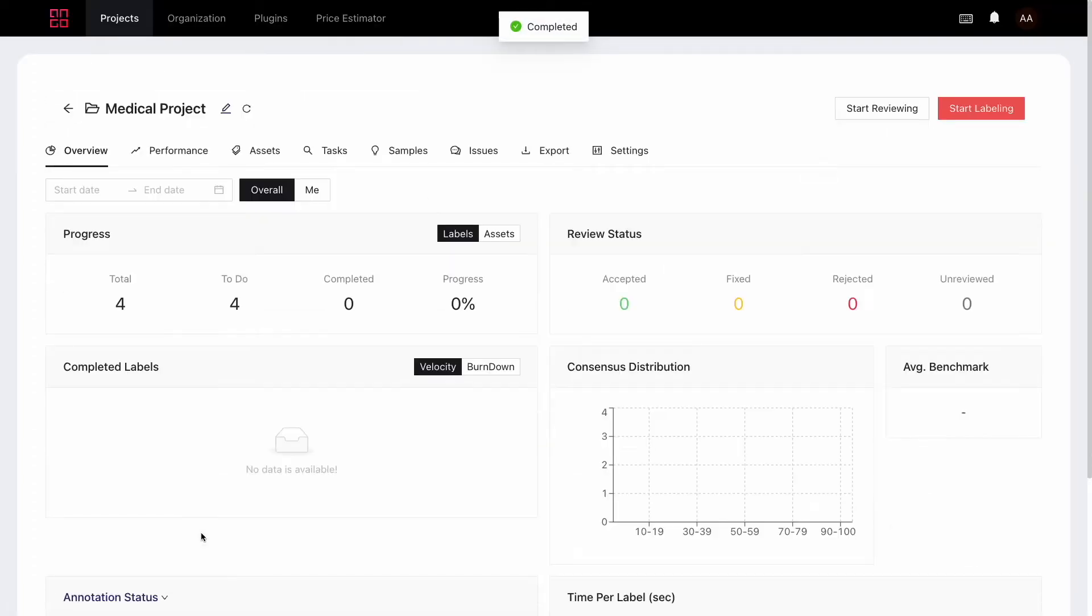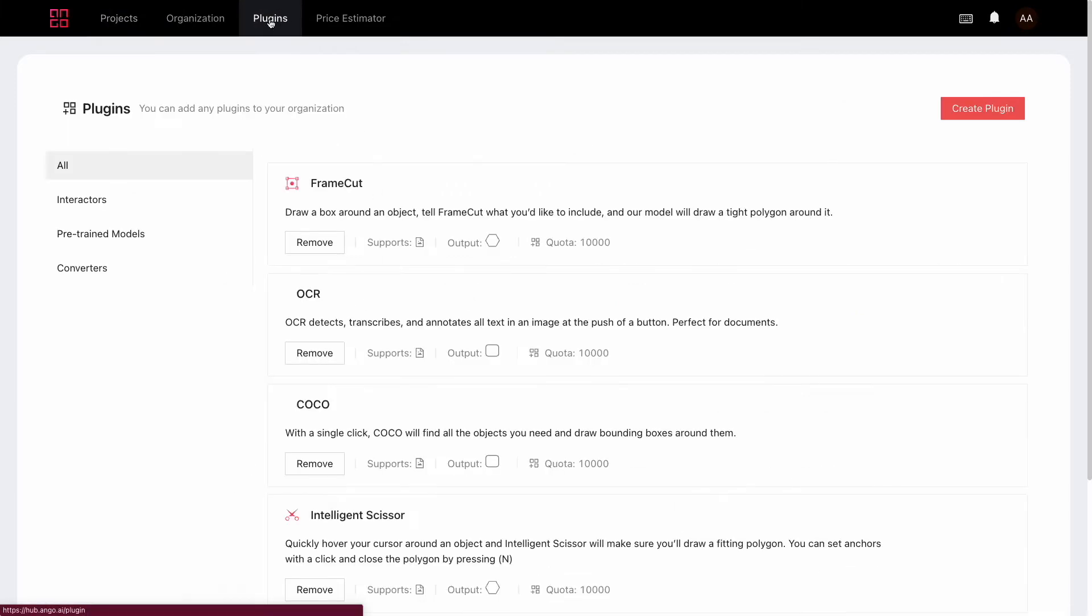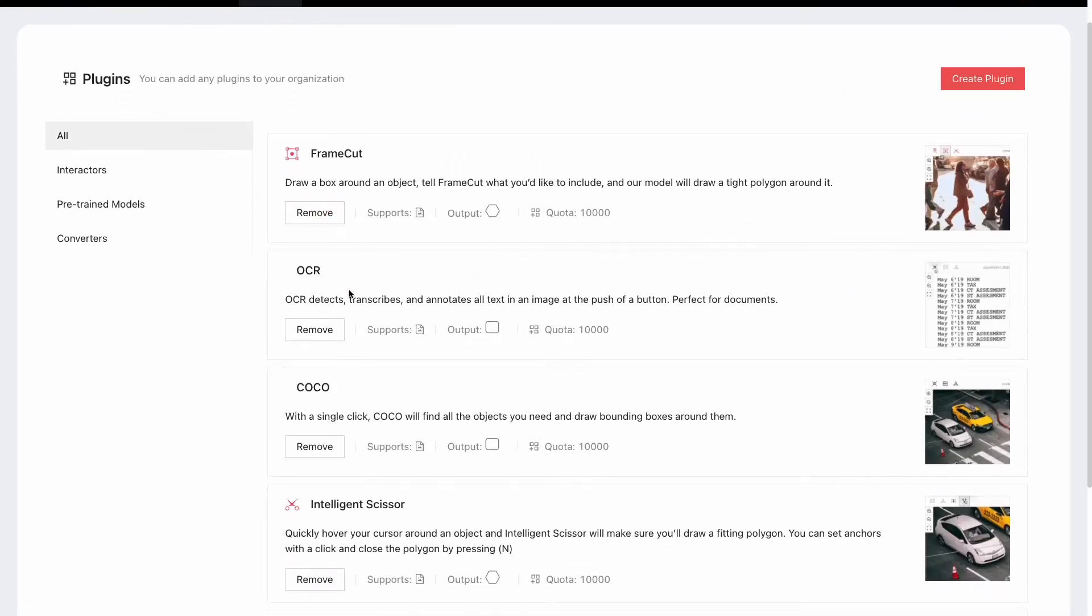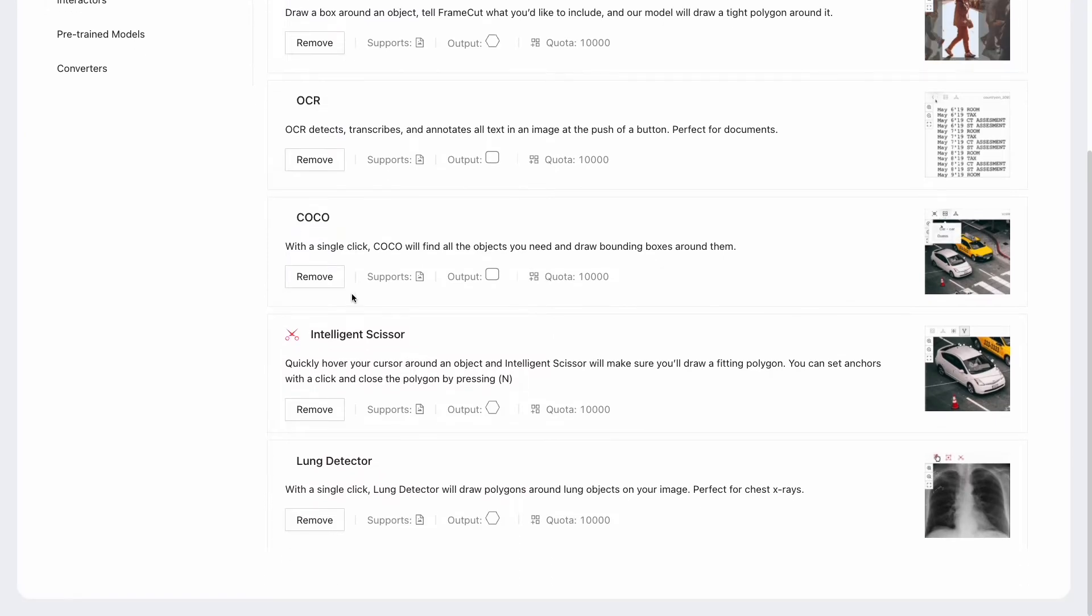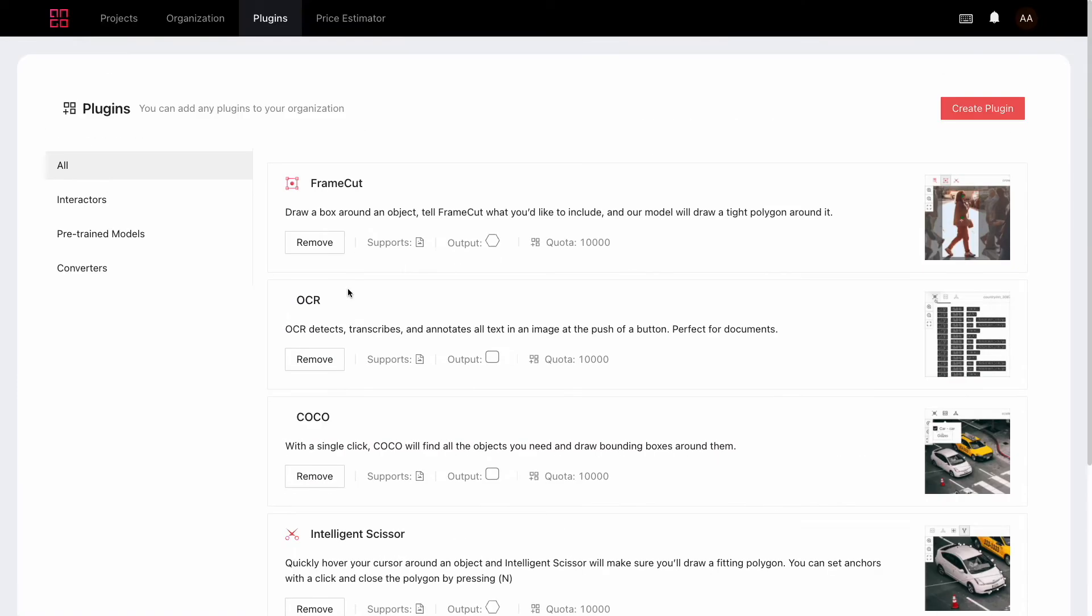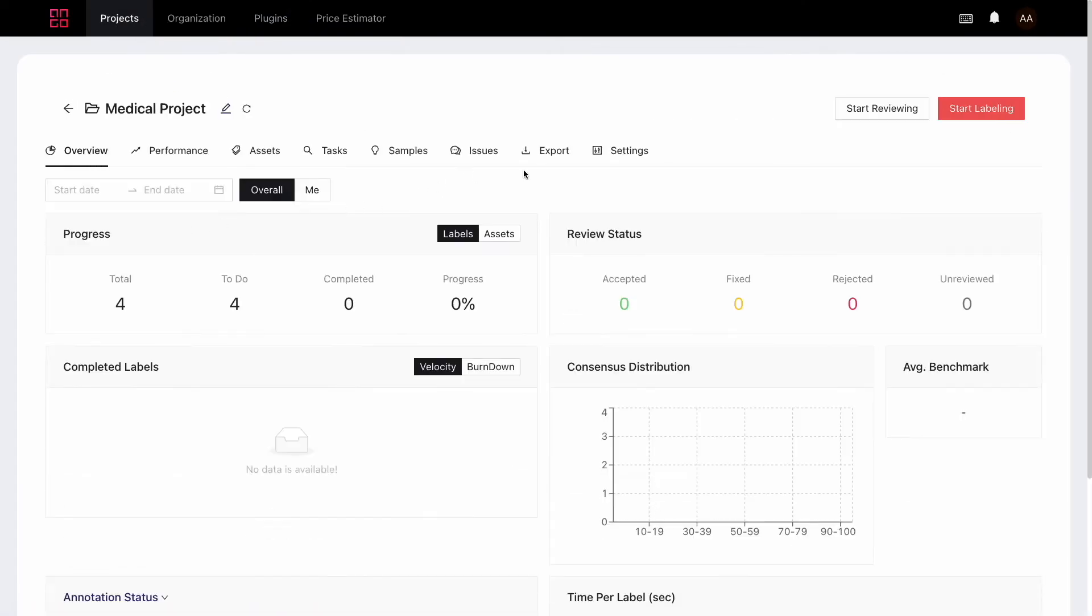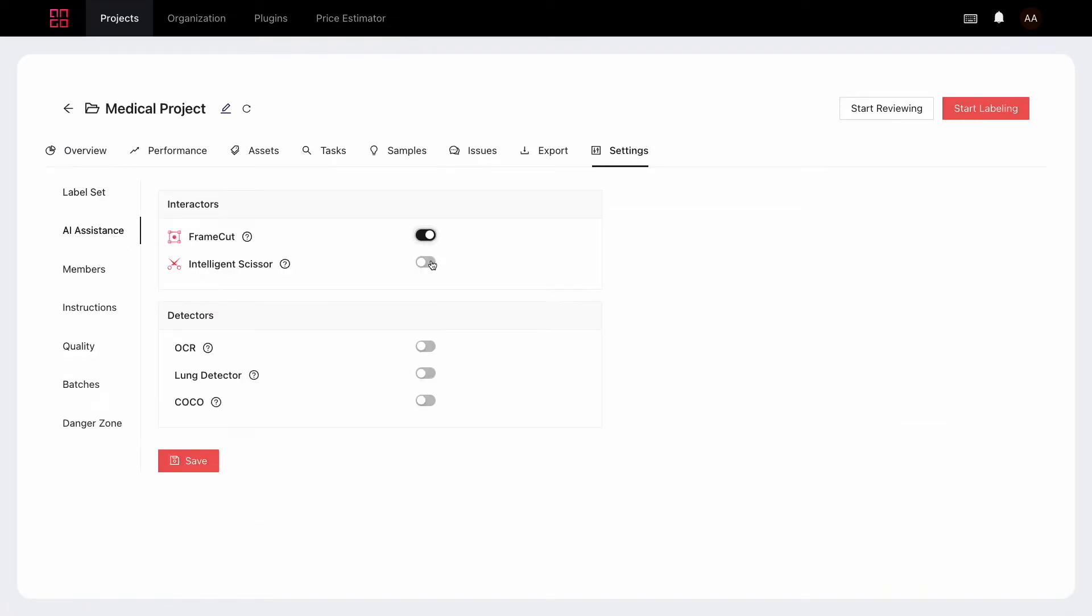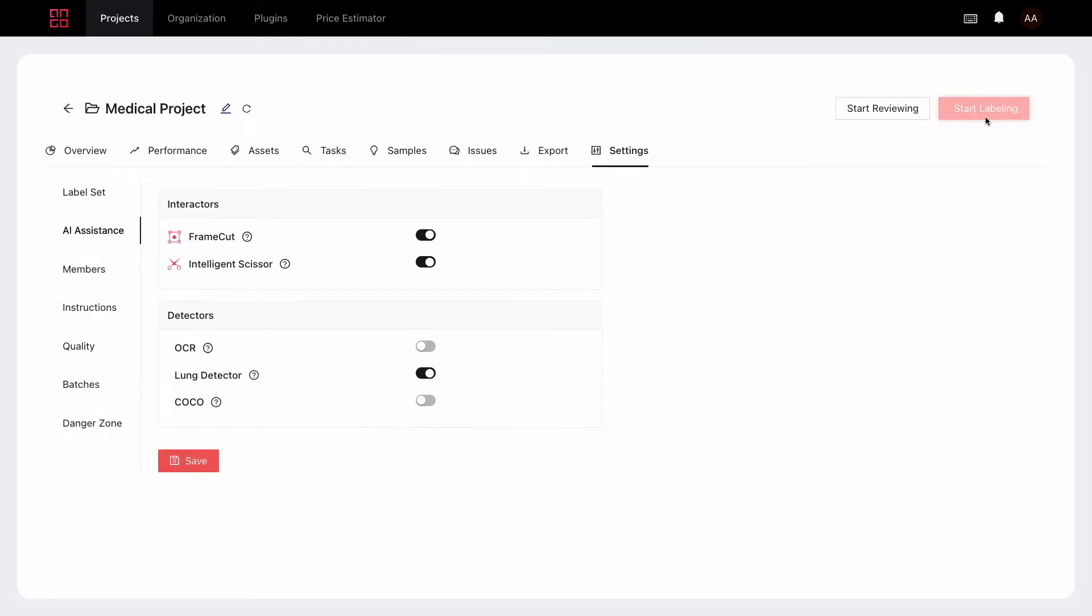Okay, we're almost ready to go. If you plan on using our AI assistance plugins, which we highly recommend, head over to the plugins page and make sure the ones you need are enabled for your organization. Back in the project then go to settings, then AI assistance and enable the plugins you need in your project. In my case, I'll be using frame cut, the scissors, and lung detector. We're all set up now. Just click on start labeling and we're off.